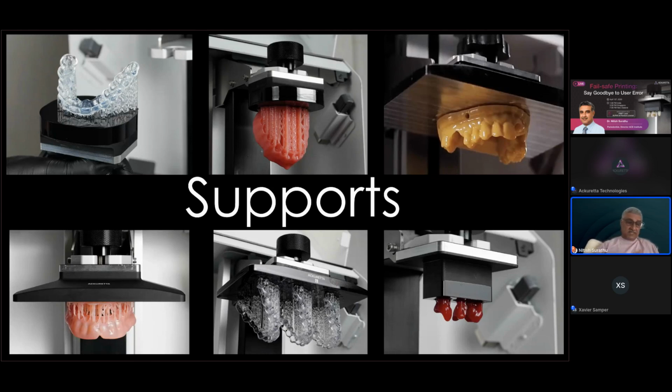On the lower left, there's another denture. This needs less supports in terms of density because you are connecting those supports directly to the oral surface in a horizontal orientation. And that's usually quite easy for the printer to do. And therefore, you don't see as many supports in that particular position.